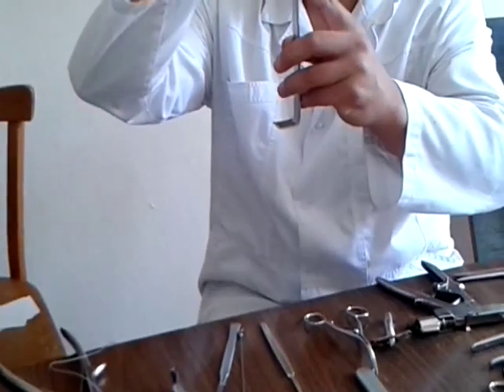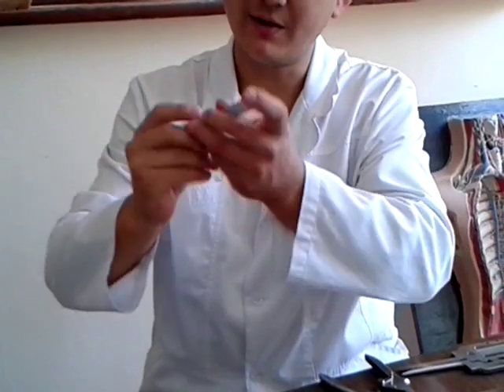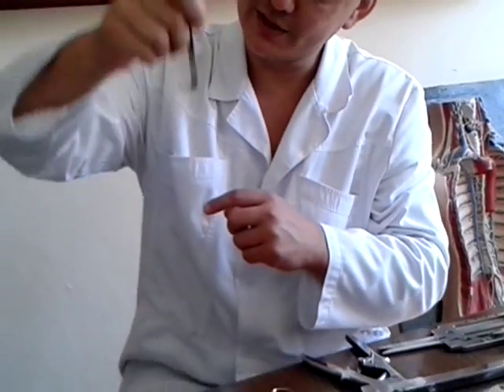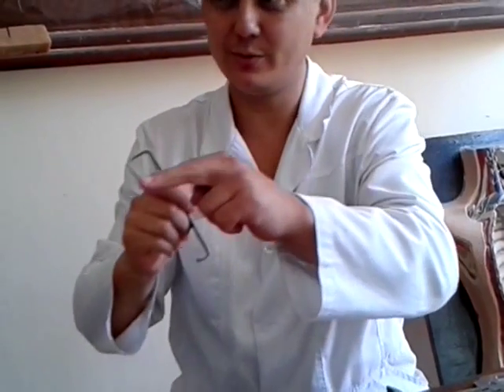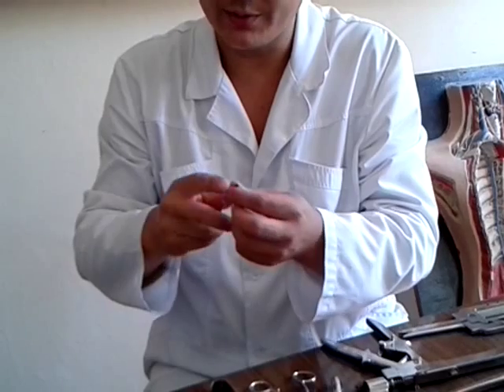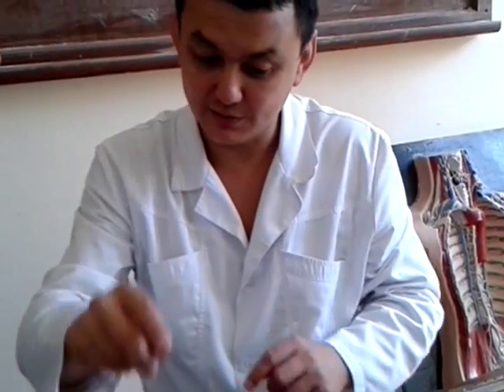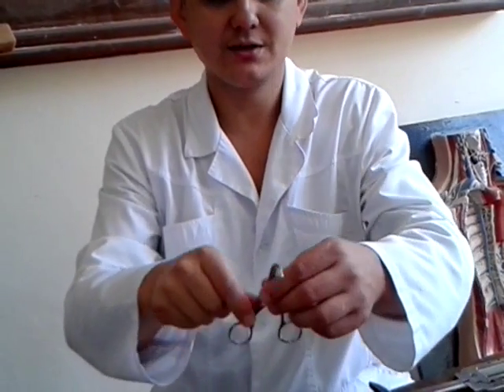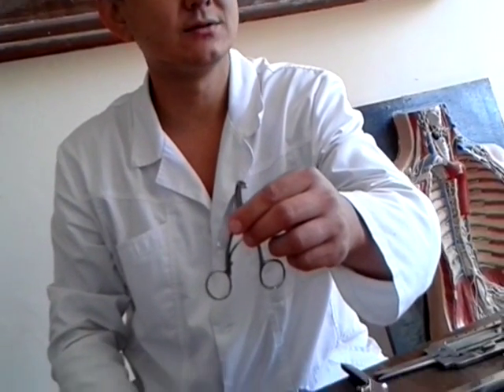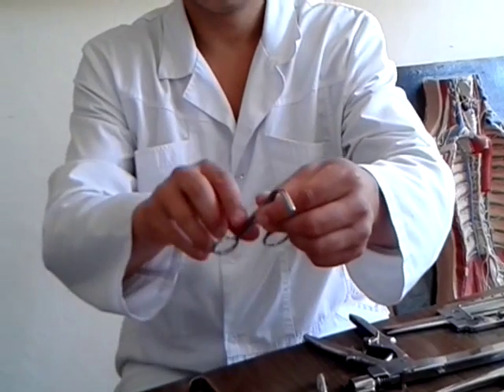For superior tracheostomy, we remove the isthmus down, while for inferior tracheostomy, we remove it up. After that, we cut the anterior wall of the trachea. After cutting the trachea, in the special position I mentioned, we use the tracheodilator, Trousseau's tracheodilator.